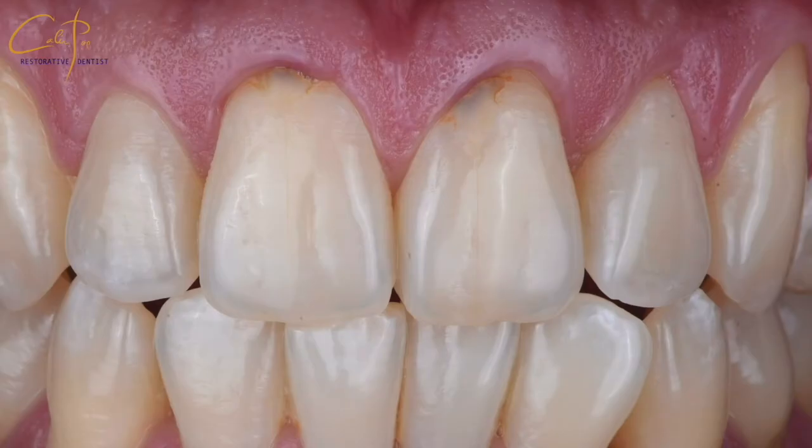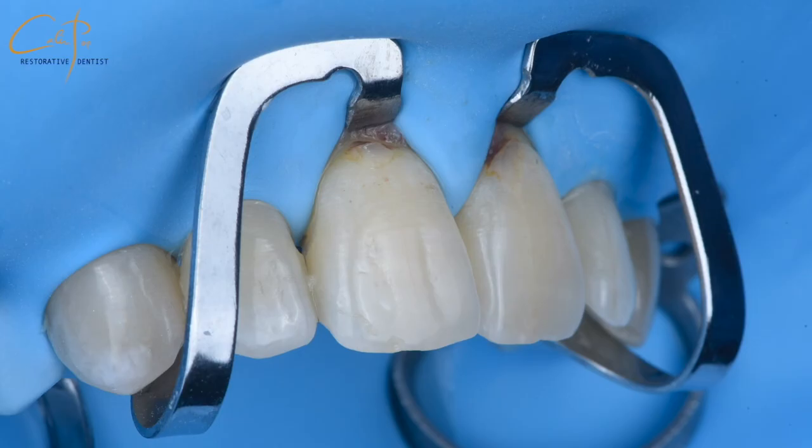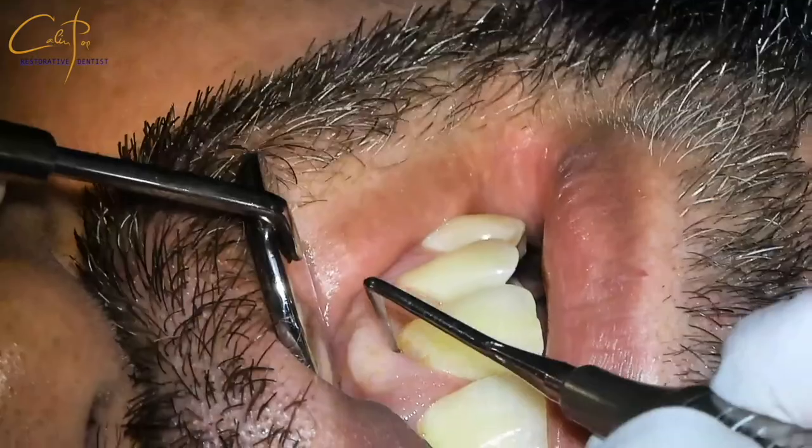Let's see another case with class 5 lesions, this time in the anterior area, and understand the integration of the rubber dam isolation and all the advantages of this approach. The challenge here is to isolate while dealing with old overhanging restorations extending under the gum level, which complicates working while isolating anteriors.